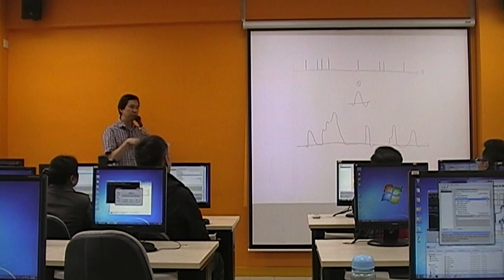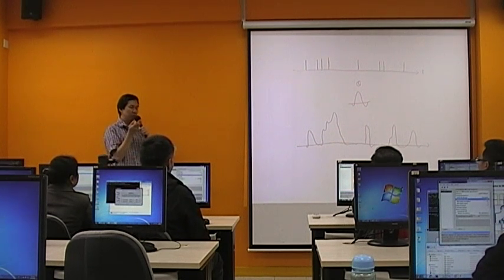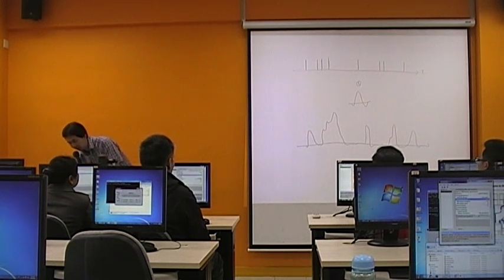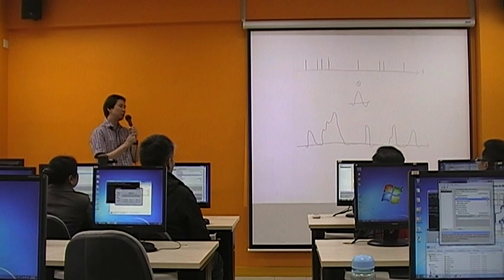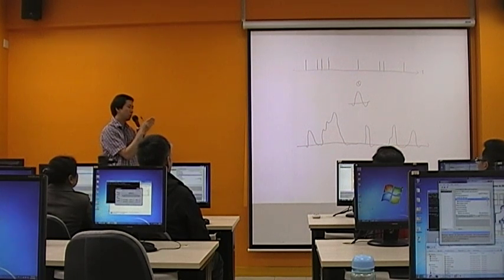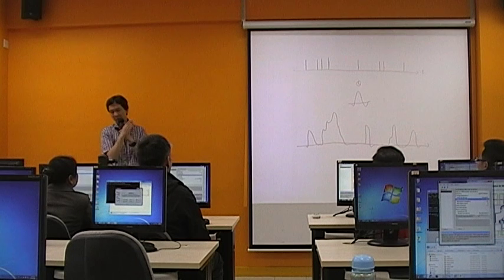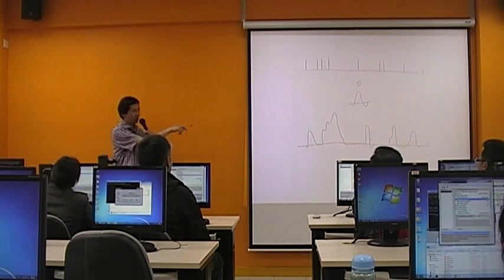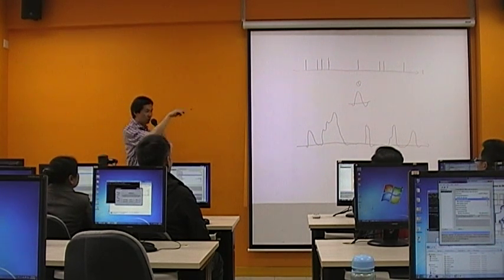So SPM first will scale up the resolution in the time domain by a factor of this micro time resolution, which means that for each TR, you divide the TR into, let's say, 16 time bins. So all the subtle changes in this expected time course will follow this time resolution.